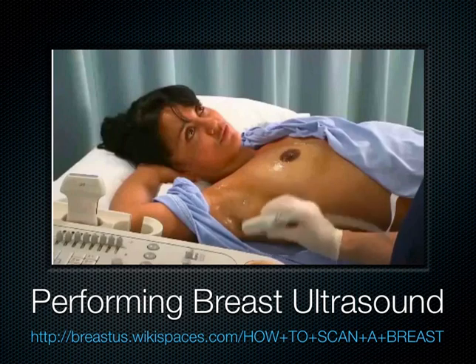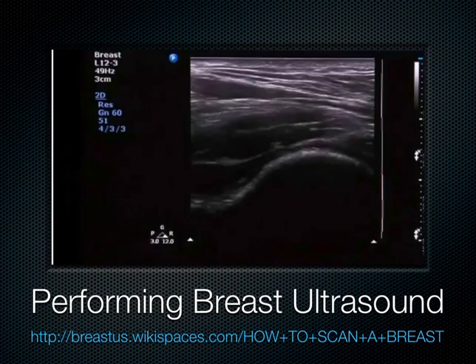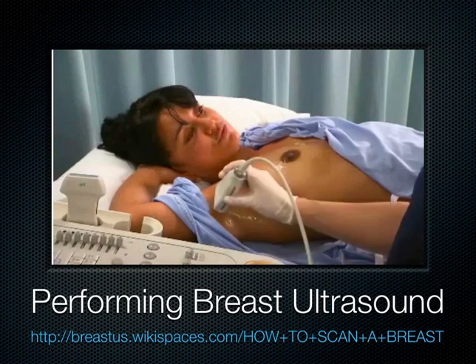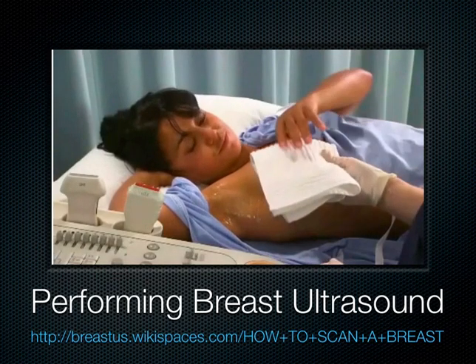Return the transducer to the midline in the longitudinal plane. Optimize the image, then freeze, annotate, and save the image. Repeat the process in the transverse plane. Give the patient a towel or cloth to wipe off the gel.